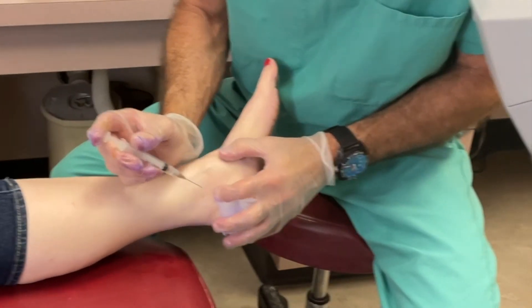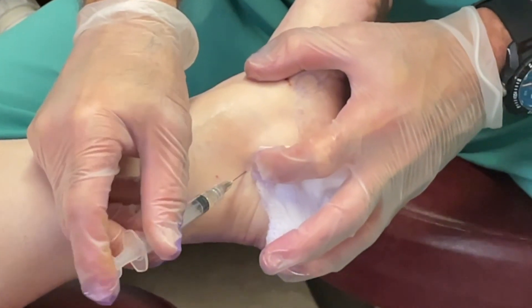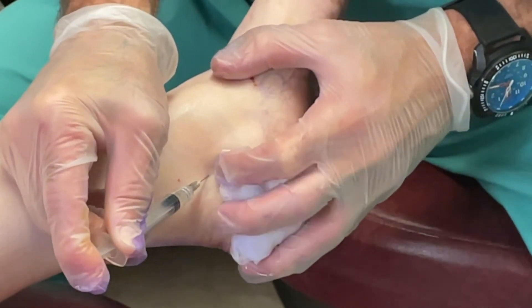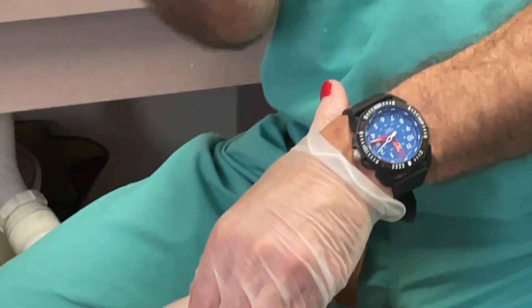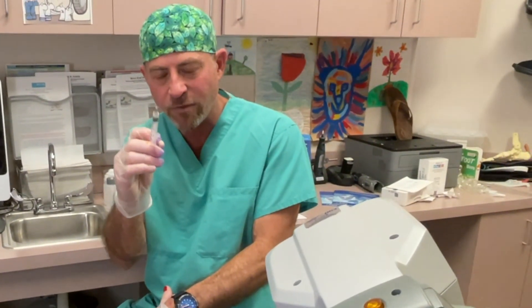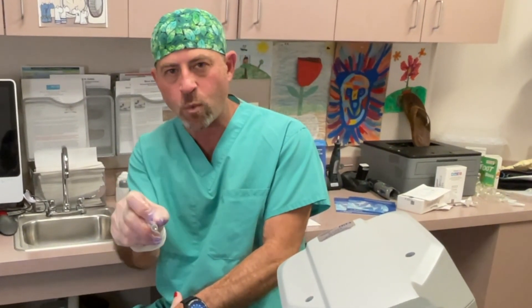I always try to get just a little bit started. There we go — we're going to get this right in here. Here's the leg bone; the tendon is right in the back of it. There it is. Good. What I had to do is push that placenta tissue through a very, very small needle and it's hard to get it through there, but once it's in, it goes right in there.